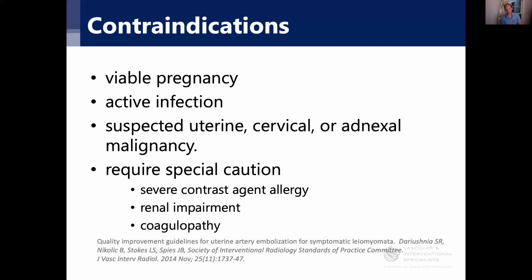I mean, outside of those three true contraindications, the rest of it is all more relative contraindications or more that require special attention. So I listed a few things here, and then I'm going to go into some of the things we've kind of learned about the procedure over the last years. So contrast allergy, renal impairment, coagulopathy, these are all things we manage. We do a lot of angiograms. Contrast allergy, we prep the patient or we use CO2, same thing with renal impairment, and coagulopathy we can kind of manage.